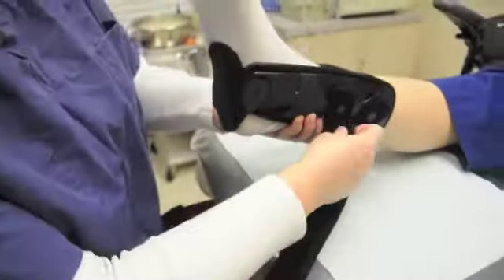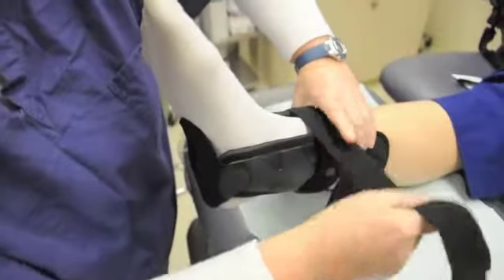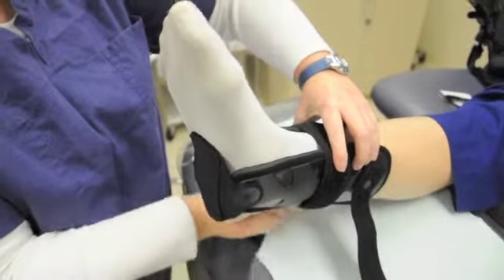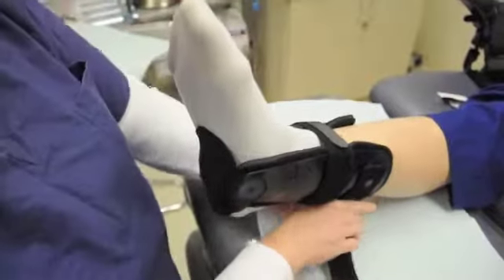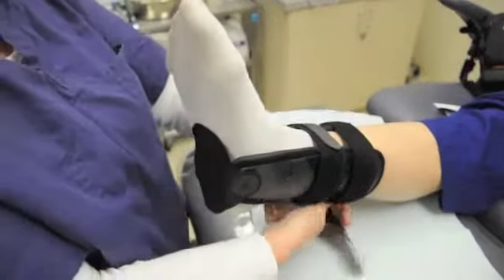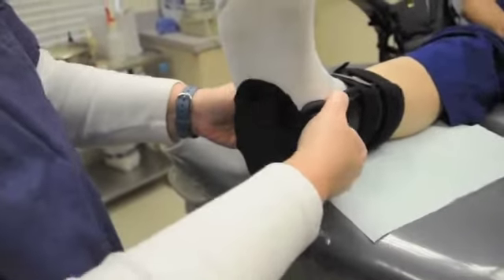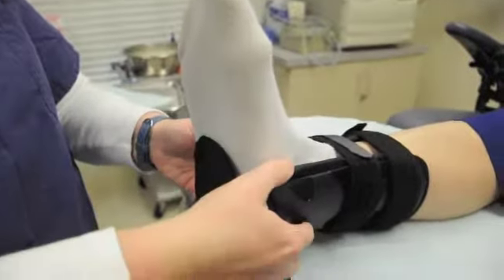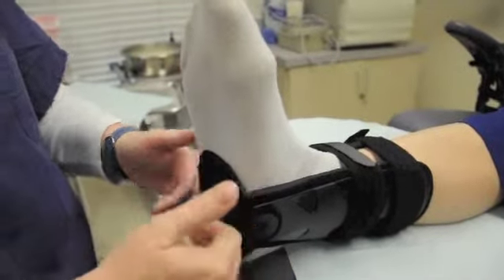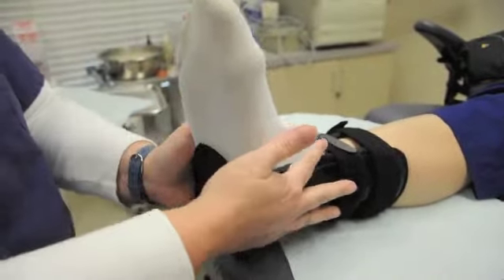You have two straps. Each one will go around — you want it to be snug. It is actually easier for the patient to put this on with them standing on it. This little piece down here, even though it looks like it is loose, once they stand on it this kind of shifts forward and sits on their heel just like this. It may sit just slightly forward on really big feet, but this should sit kind of in the heel and just a little bit into the arch. The goal of these two stirrups is to come right up to either side of the ankle so that Penny cannot go side to side.